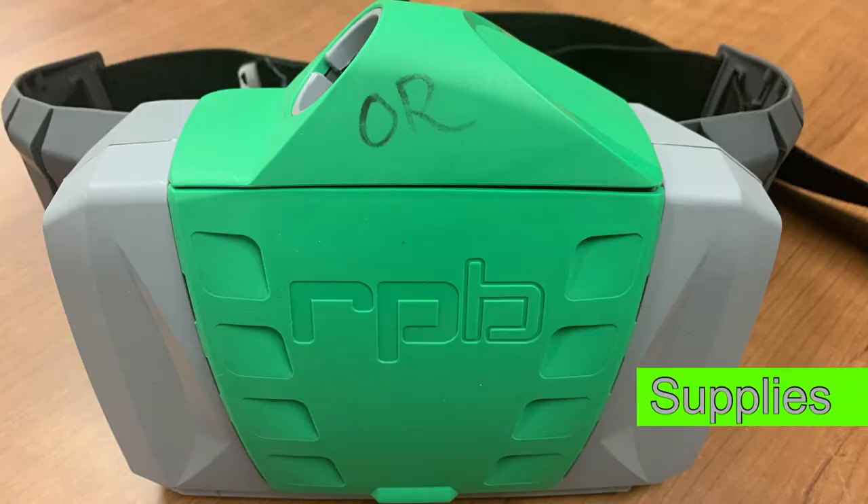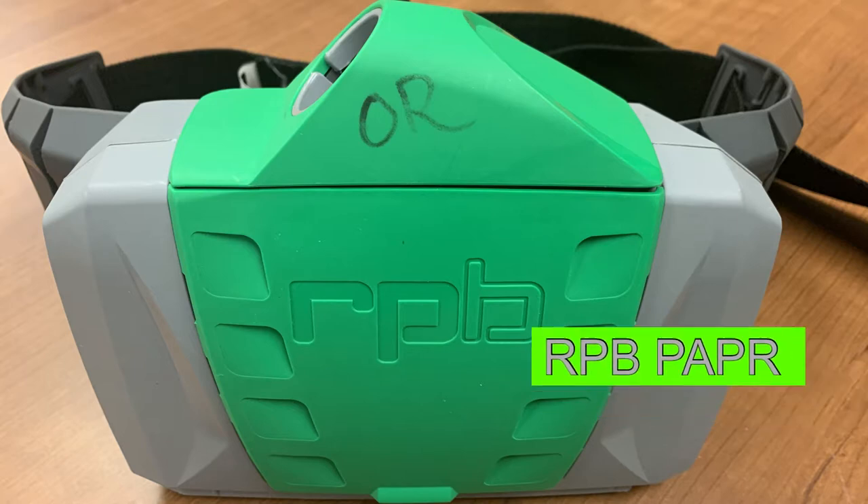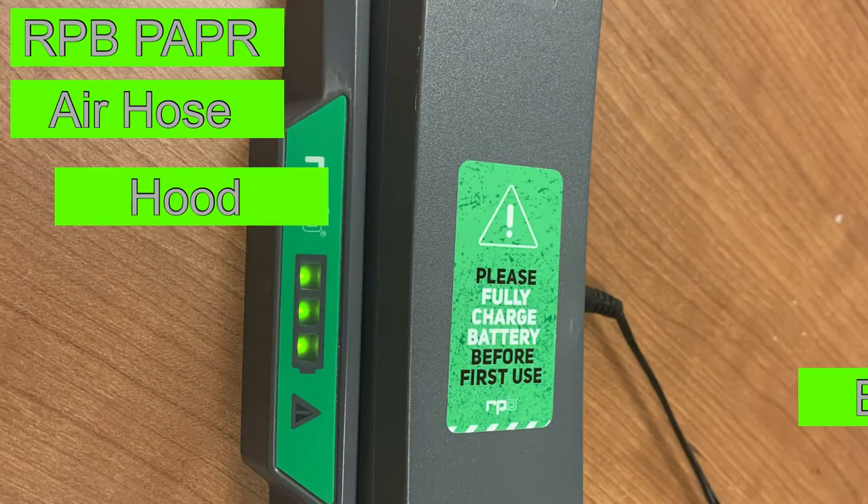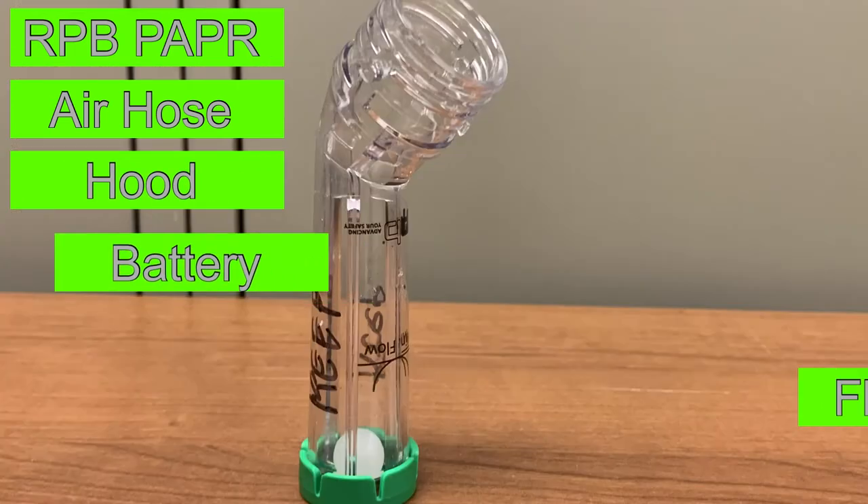You'll need to first make sure you have all the necessary supplies on hand. You'll need the RPB unit, the air hose, the hood, a fully charged battery, and an airflow indicator.